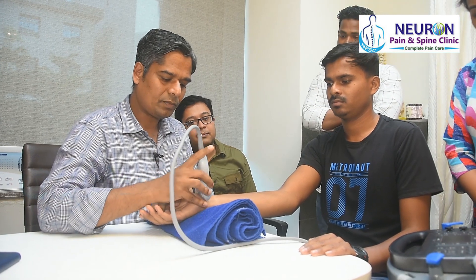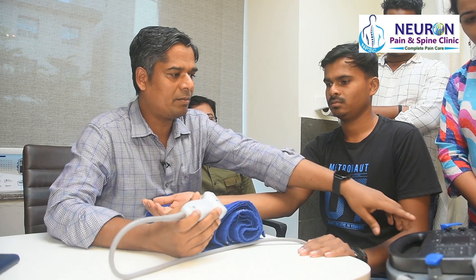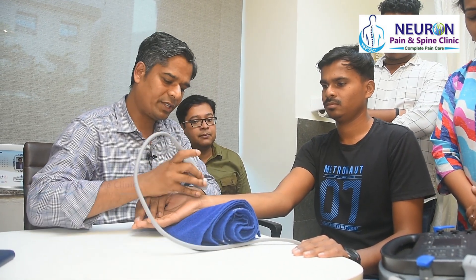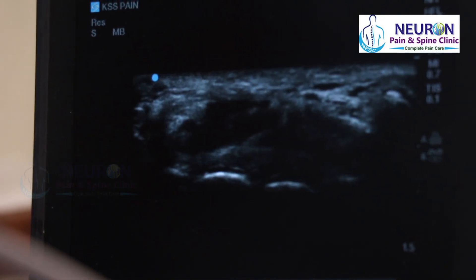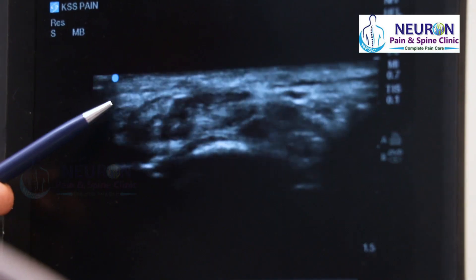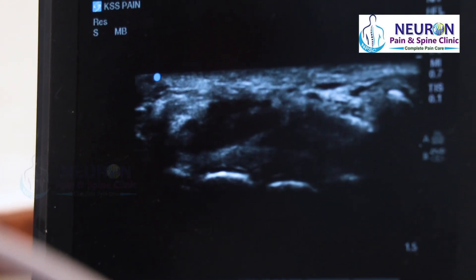This is a high-frequency linear probe. I have done the settings in my ultrasound — you can choose the highest frequency. What I see on the screen: the left of the screen is radial. One can see the radial artery there, pulsating. And this side is ulnar.